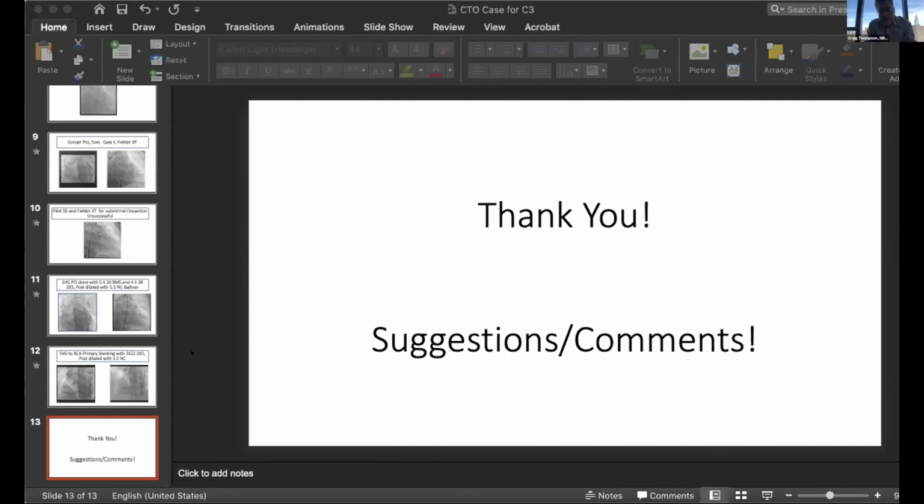Yeah, and I would piggyback on what Ashish is saying in the sense it's the concept of the base of operations. So you were going retrograde, got stuck, got into a zone that made you uncomfortable from a safety perspective, so change the plan, change the script. Part of it is bypass the proximal cap, come down antegrade. Ideally we want to bring the retrograde system to the proximal cap, but many times that just simply doesn't happen. Then we have to choose an alternate course, because you might be able to manage the safety aspects bypassing the proximal cap better than you can with a knuckle retrograde that's exploding until you can get the systems together.